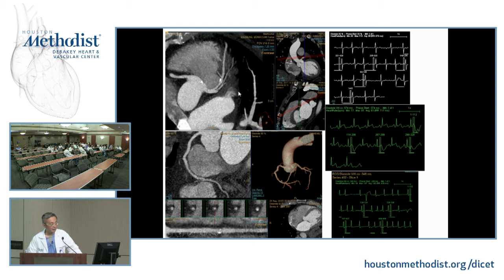And I show you here, there's a clot, this is the left atrial appendage. The clue here is the left atrial appendage, so most likely the patient has AFib. So this is the EKG. I mean, usually we do it the opposite. Well, it's important for you to know, the exercise should be the opposite. I give you an EKG, you tell me which type of scan parameter you use, all right? But this is just for fun.